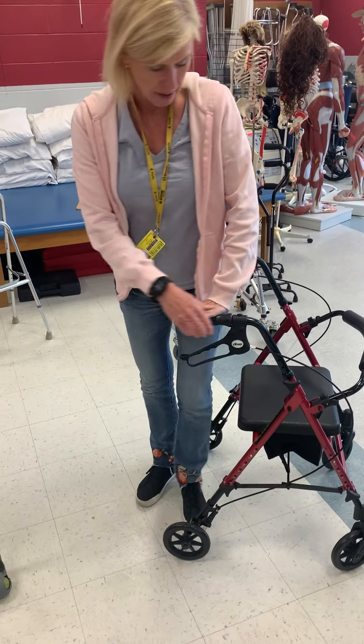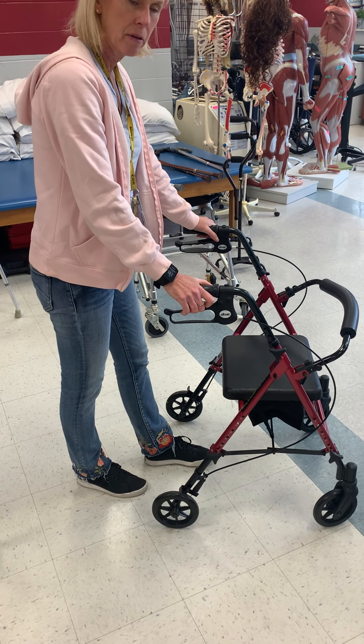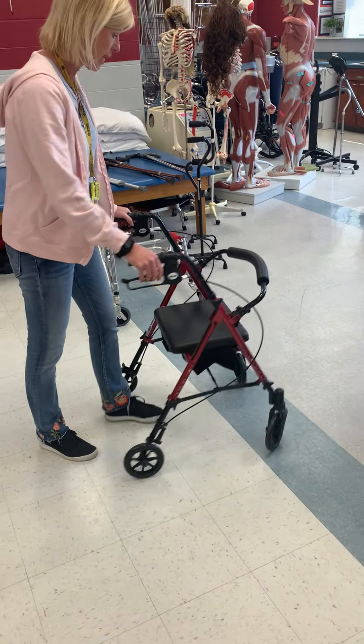When they get up, they push up, turn around, and in order to unlock, they pull up. I get these for my patients all the time — they're really nice to have.